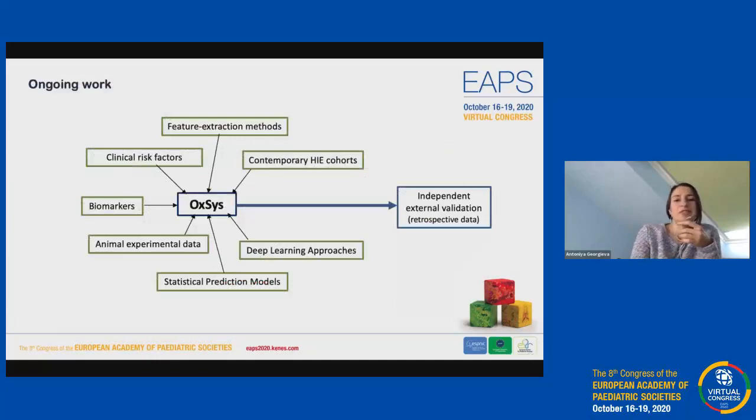So a very general slide. As I said, I'm very ambitious about making the best out of the heart rate. It's only one vital sign, and it is going to be limited. It's not going to resolve all our problems in fetal monitoring. It's very important that people keep on looking for other solutions, ideally blood pressure or blood flow of the fetus to the brain. But for the moment, this is the only thing we can non-invasively measure over time during labor, and we need to make the best out of it.